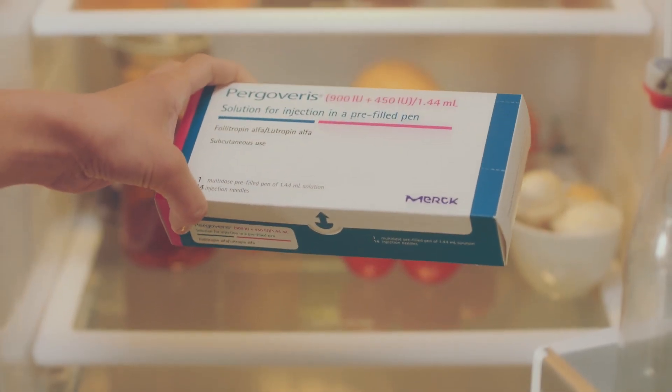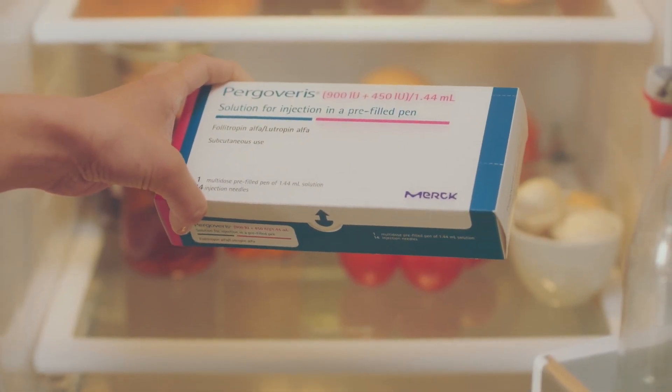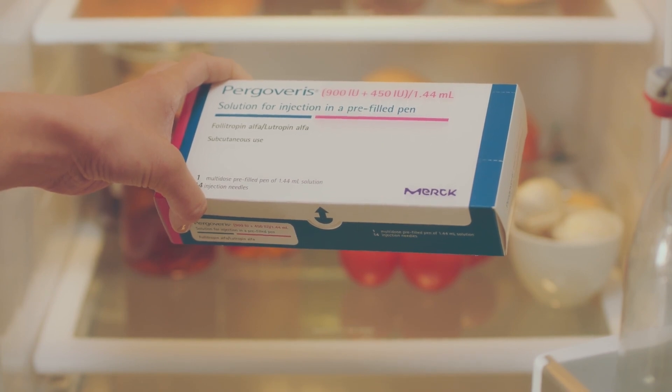It's important to keep your pen in the fridge within the original packaging until you need to use it. Do not freeze the pen.